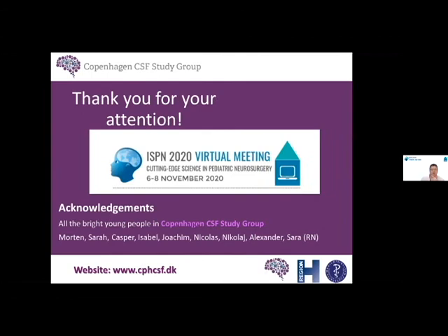And one live question: is it CE marked for children in the European Union? The devices, I think they are, if they're applicable in children. Well, yes, they are. I didn't show this slide, but we've used telemetric devices in kids from about 6 months to almost adulthood, to 18, and of course they're applicable in adults also.